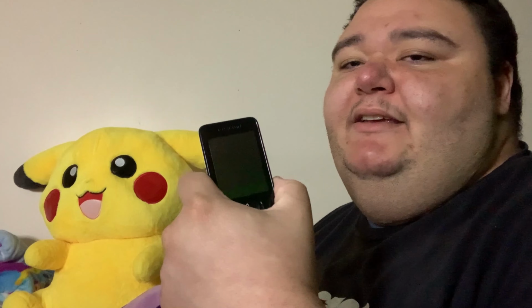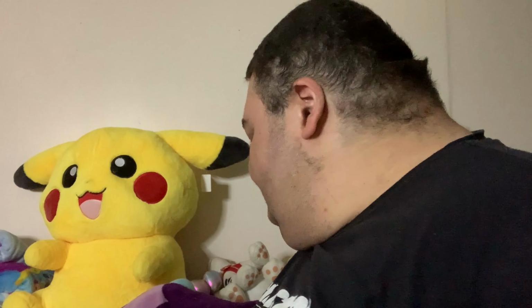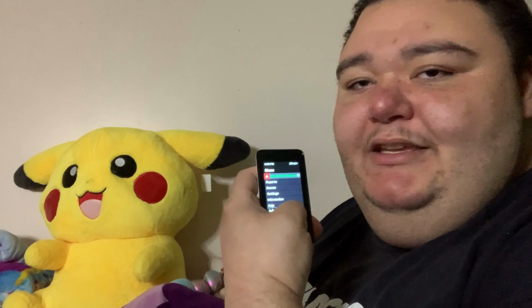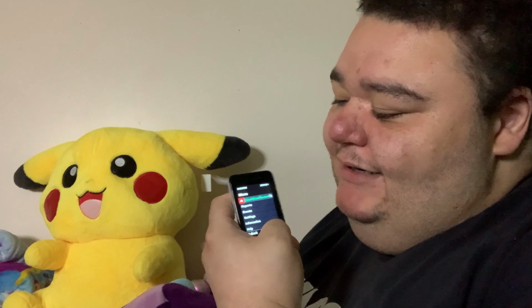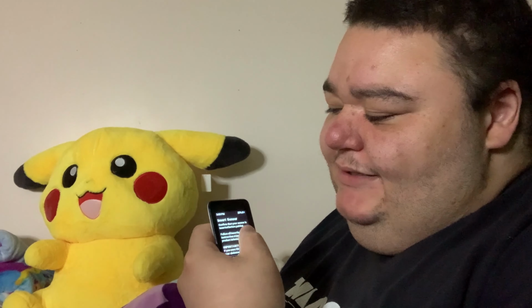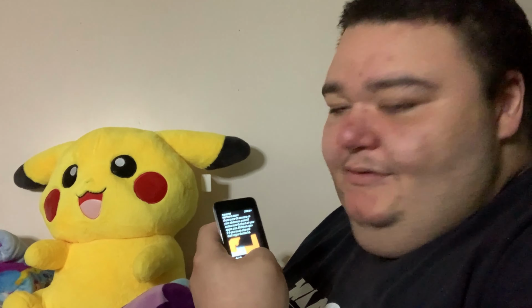All right, we're going to put the sensor on this receiver first, and then I'm going to do my phone load later, so you guys will see that for sure. I'm going to be going back to my chair for that, so I'm sticking to my bed area for a little bit. So, same thing as before, receiver code. It doesn't do the picture thing like the iPhone does. You have to do everything manually. And my battery is 25% right now. To set it up, you hit menu, and then you say start. See how it says start new sensor? And then insert the sensor and all the important stuff like you did before.